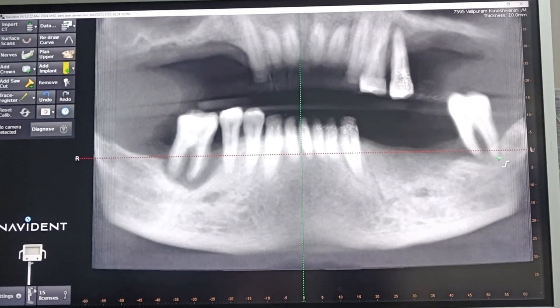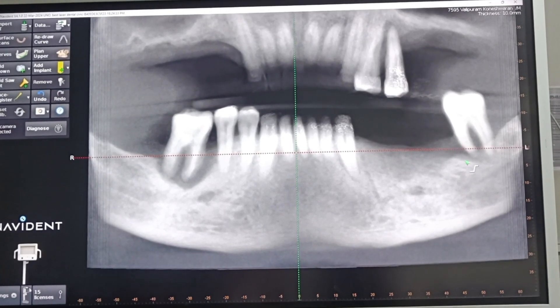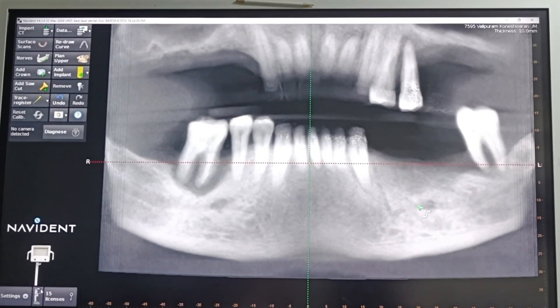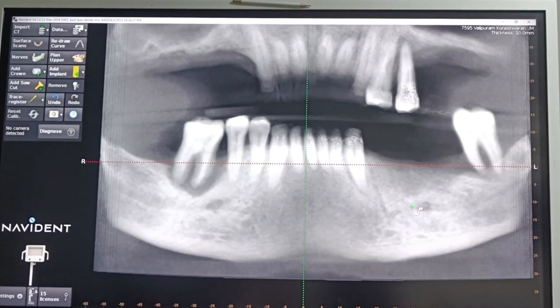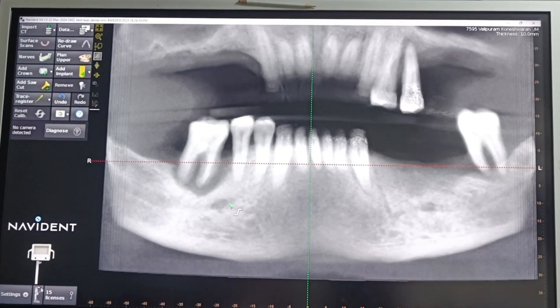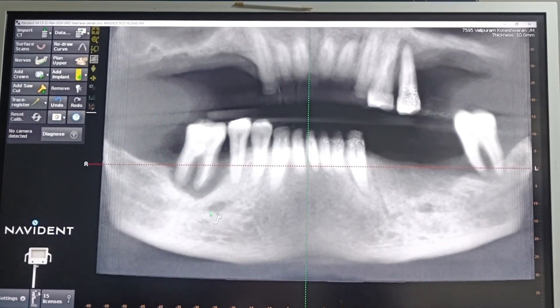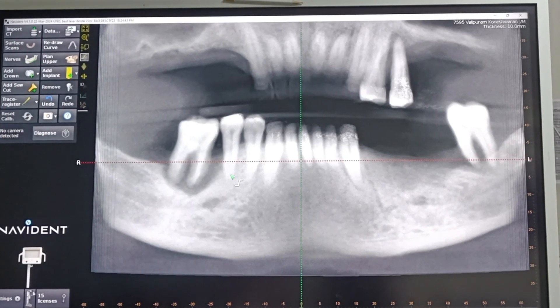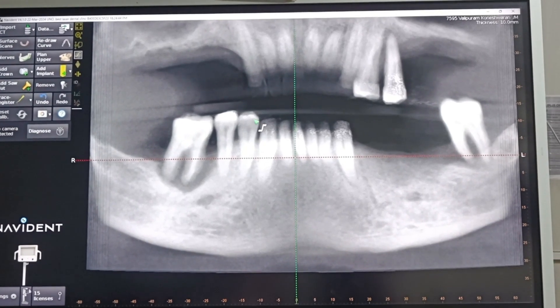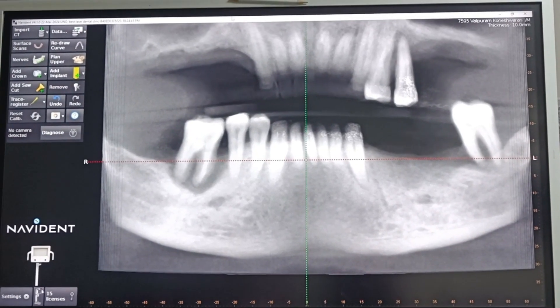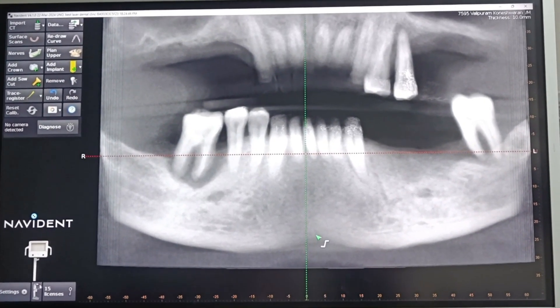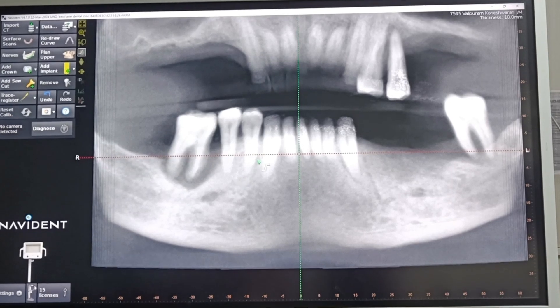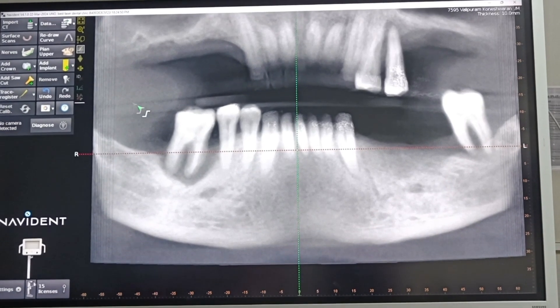Just in front of the second molar we have to place one implant, in the mesial root or distal root of 7. Around the root there is severe bone resorption. You can see the mental foramen here. On both sides the mental foramen is distal to the second premolar, which is quite unusual — usually it will be between the first and second premolar.